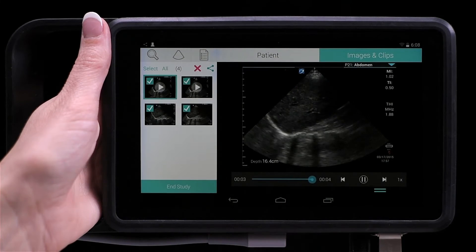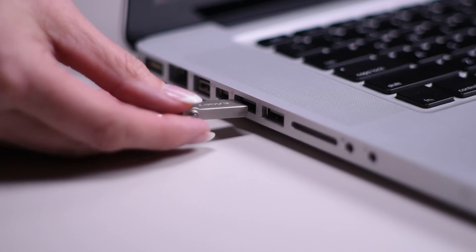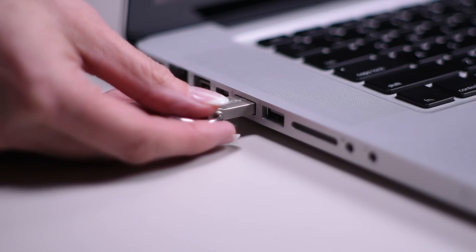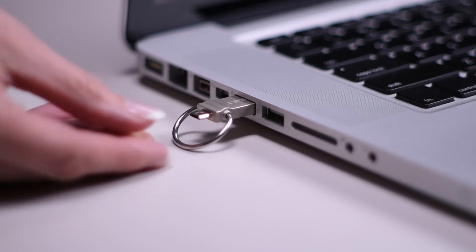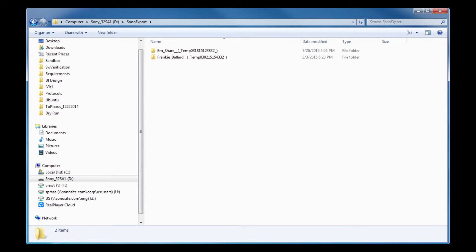To view your images on your computer, plug the standard USB connector into the port on your PC. You'll find images in the folder called Sono Export on your USB drive.